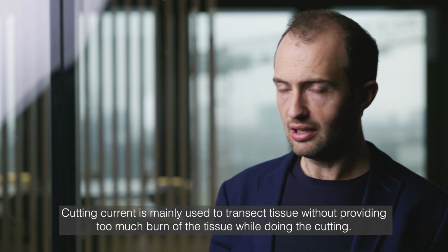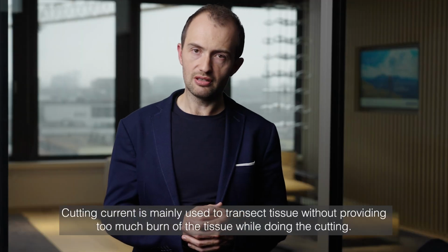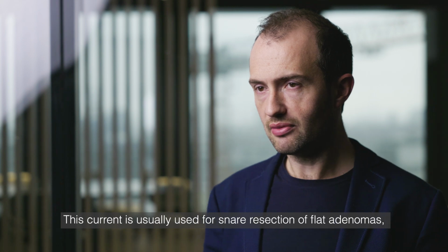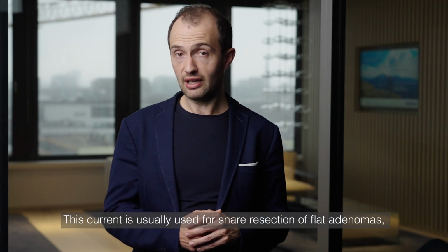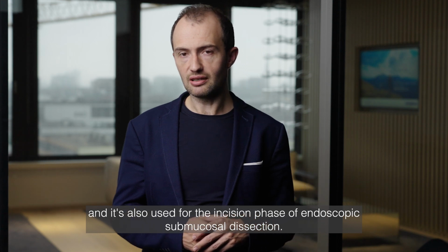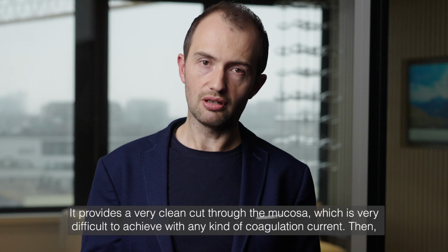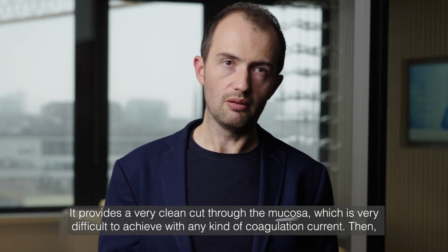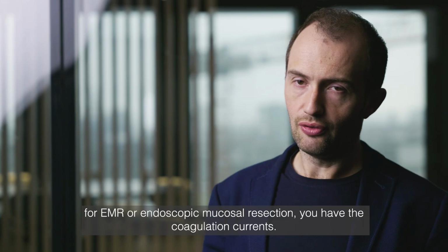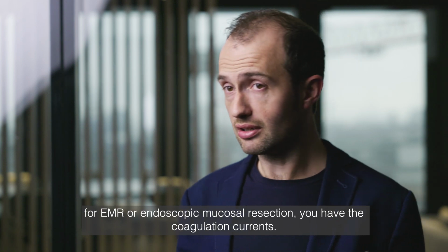Cutting current is mainly used to transect tissue without providing too much burn of the tissue while doing a cutting. This current is usually used for snare resection of flat adenomas, and it's also used for the incision phase of endoscopic submucosal dissection. It provides a very clean cut through the mucosa, which is very difficult to achieve with any kind of coagulation current. Then for EMR, or endoscopic mucosal resection, you have the coagulation currents.